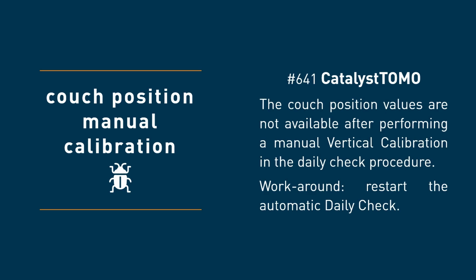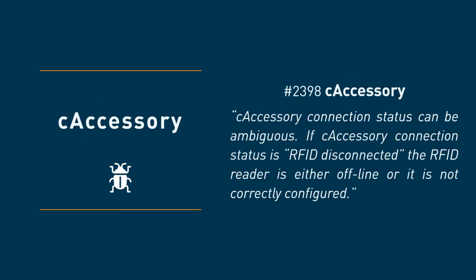And finally, an issue that concerns C accessory: the connection status can be ambiguous and not clear to the user. The notification RFID disconnected can mean either that the RFID reader is offline or that it is not correctly configured. However, if it has worked once already, the option that it is offline, that means not powered on, is more likely.